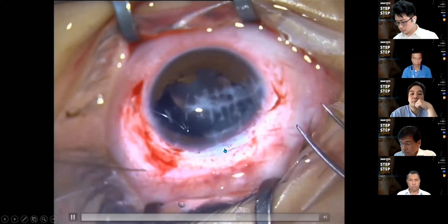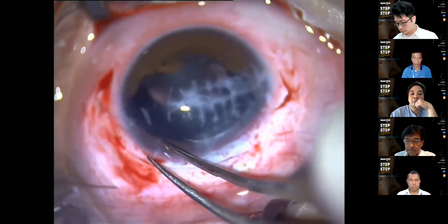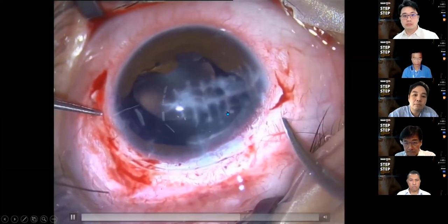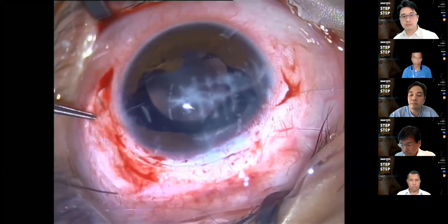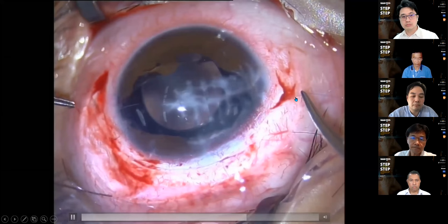One thing I want to advise you, when you try to centralize this IOL, please pull both sides simultaneously so that you get a firm centration of the IOL. I think it's caught by the iris, and then you pull. Pull simultaneously both sides and try to produce equal tension. Yeah, now the IOL looks centered.